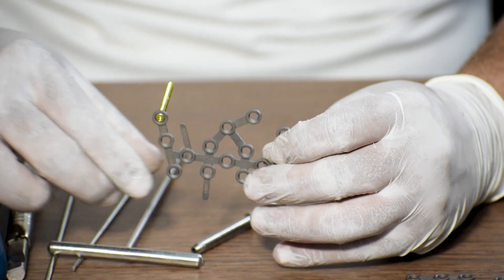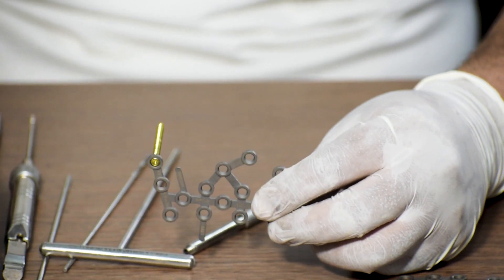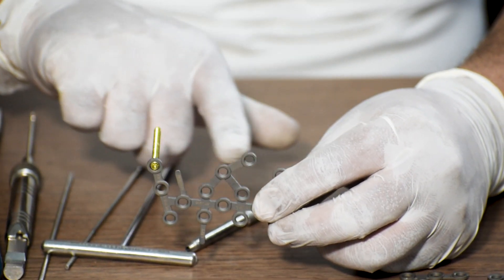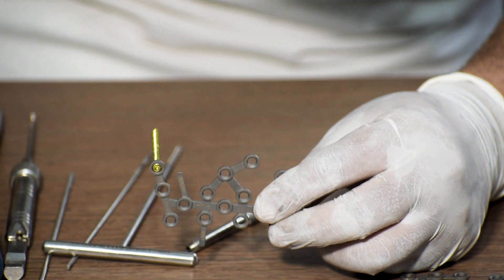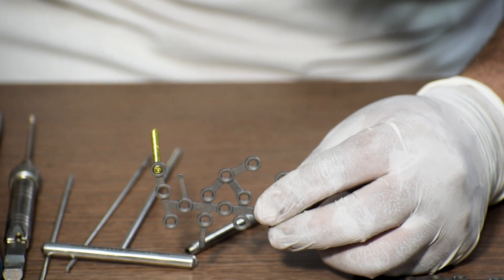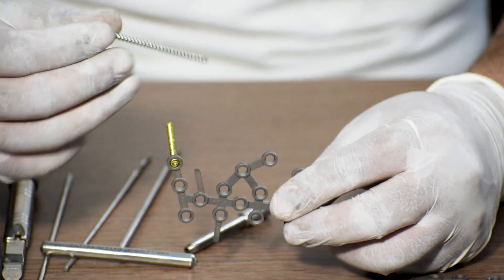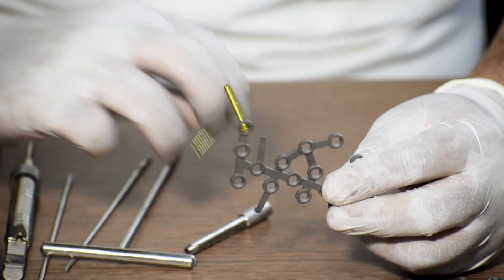Now make a note, for cancellous bones, tapping is generally not required. Also let me inform you, because calcaneum is mostly made up of cancellous bones, cortical screws are generally not used. In general, locking cancellous screws or a full thread solid cancellous screw will be used to fix this plate.